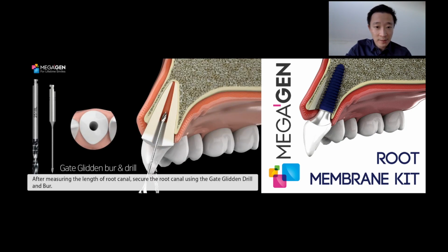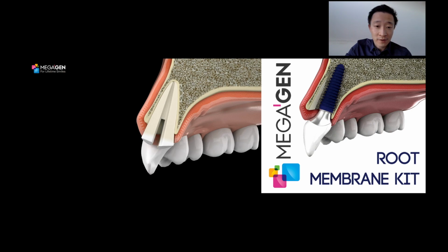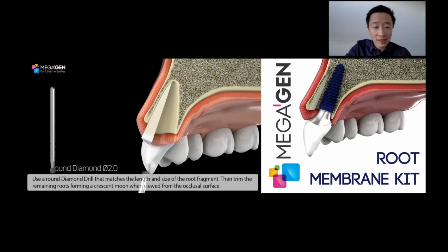So you start with a Gates Glidden burr to find the canal and the length of the working length, just like you would in an endodontic procedure. This is after you've removed the crown if it's currently present. With the initial shaper 1, you want to create a trough from the mesial to distal direction, and that will help you guide the mesial shaper 2 all the way to that working length to separate the buccal and palatal fragments. You gently remove the palatal fragment, leaving the buccal in place, and then you start to reduce the shield in thickness and sometimes in shape.